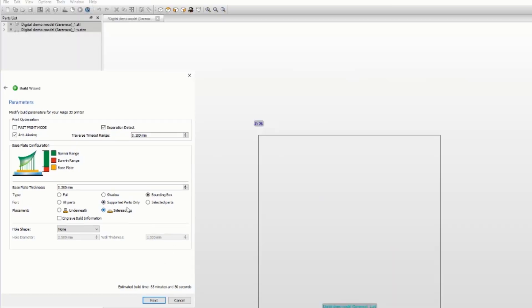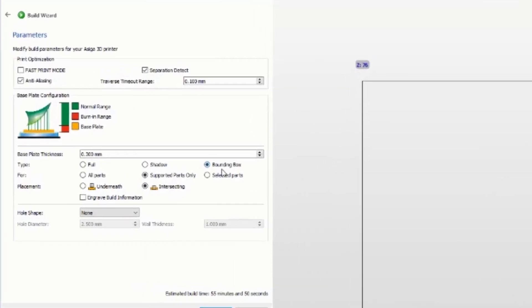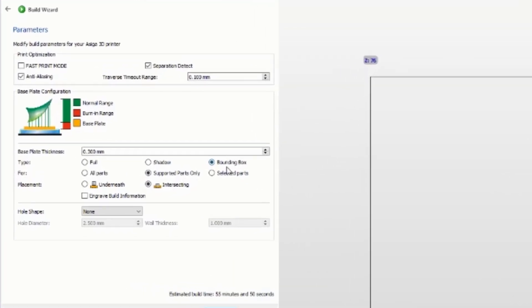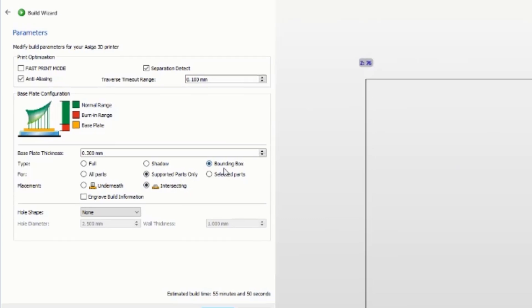You can make a shadow or bounding box for the first layer on the print platform so that the bottom part of the supports are strong enough for the section of the platform.